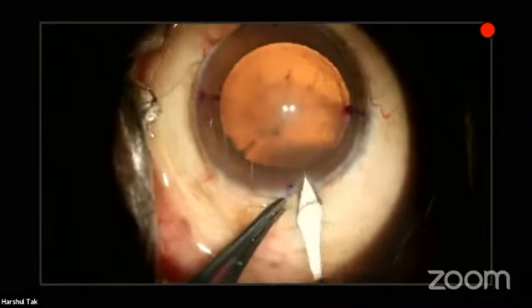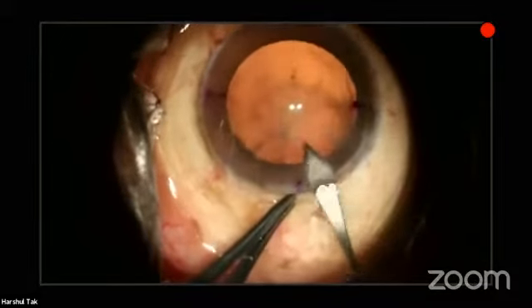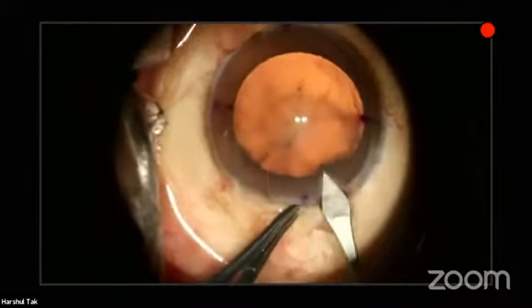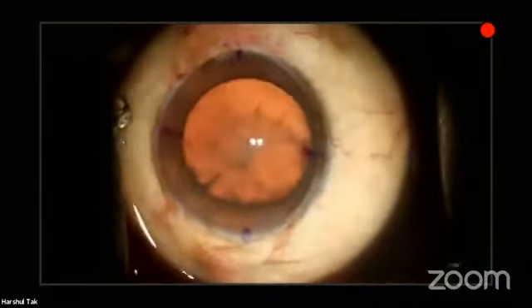So this is the 1.8 millimeter keratome. I routinely use a 1.8 millimeter incision for all my cataract surgeries.